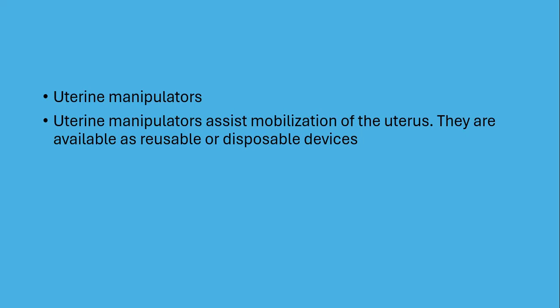Uterine manipulators. Uterine manipulators assist mobilization of the uterus. They are available as reusable or disposable devices.